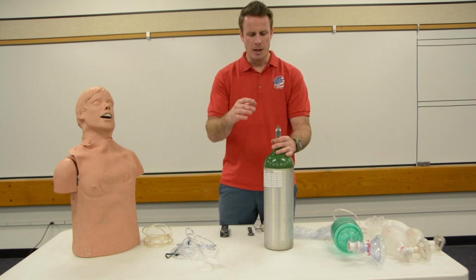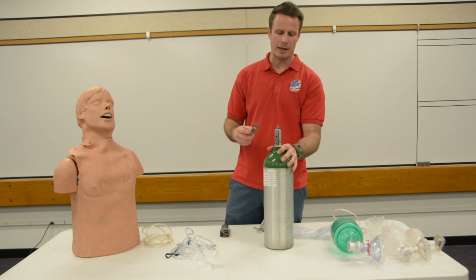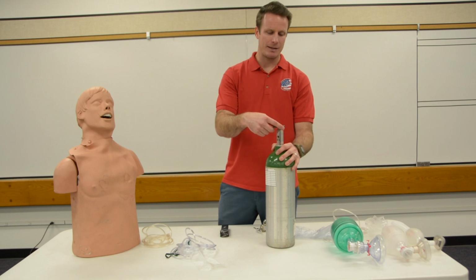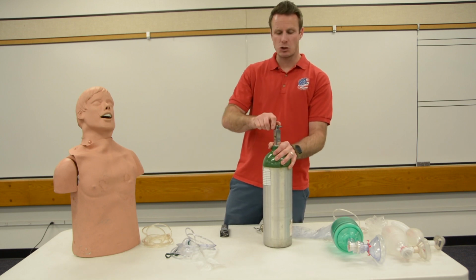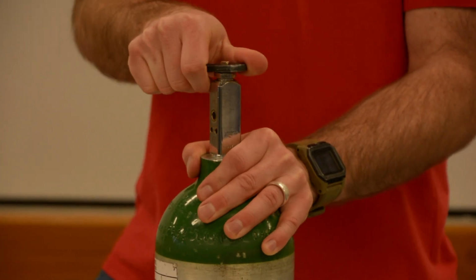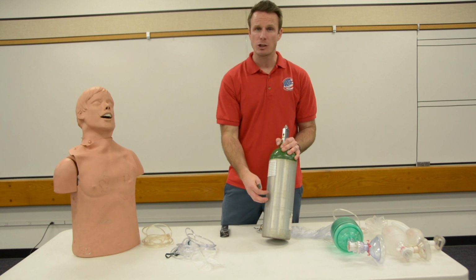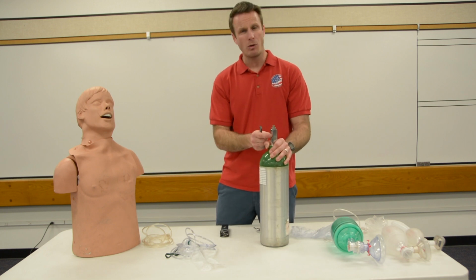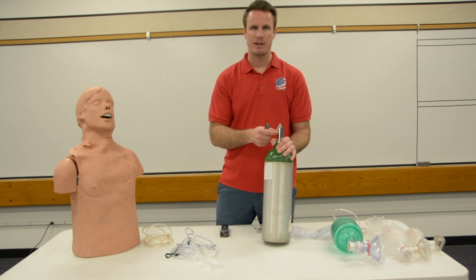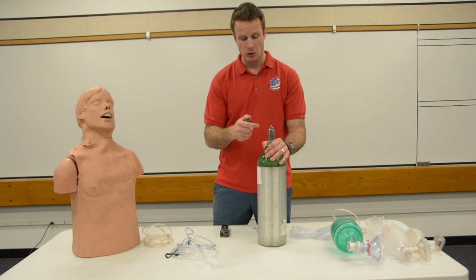So after I check and take a look at my tank, I'm going to make sure that where my oxygen comes out of is nice and clean. What I do is I just crack the tank a little bit to the left. So I go shh, and then close it up really quick. That does a couple things. It allows me to know that there's actually oxygen inside of this tank, and then also any dirt or dust or debris that's inside this little valve can be blown out, and I make sure it's nice and clean and intact, ready to use for my patient.